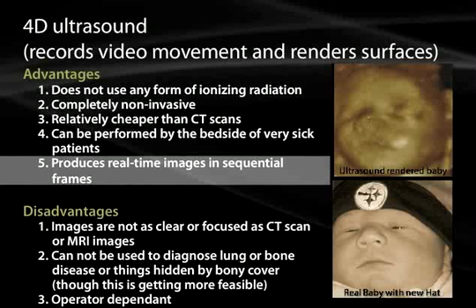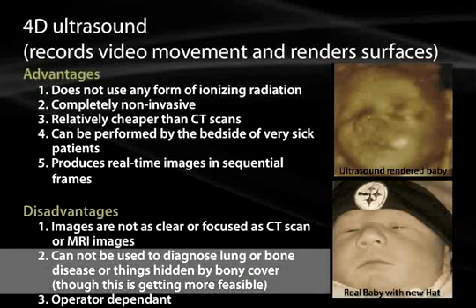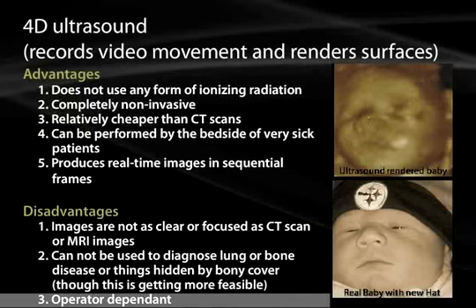Some of the disadvantages of it is that it's going to be not quite as clear as a CT or an MRI scan. It will produce shadowing on dense structures such as bone. It's because you get a sound shadow behind it. And it's very, very operator dependent, though this is starting to change with the advancement of computer technology as well, and the different algorithms being predetermined by the software as opposed to having to be interpreted and manipulated by the operator.